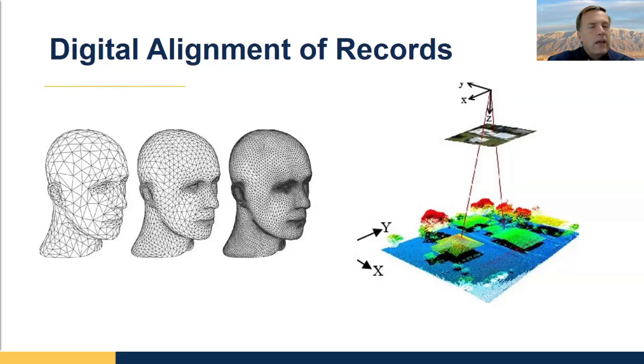File alignment rarely affects fit. The prosthetic that's made is going to fit one file, so either the file's accurate or it's not. But where file alignment comes in is when you get unpredictable changes in the bite or in tooth position, not just one tooth, but like all the teeth look like they're rotated or something like that. Oftentimes that can be a file alignment problem.